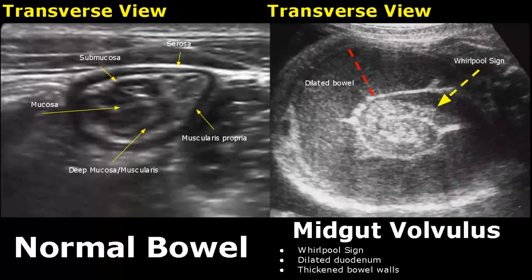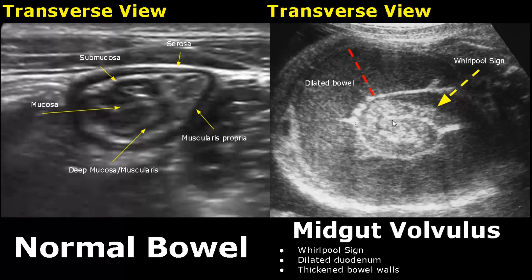Midgut volvulus occurs from malrotation of the bowel and can cause obstruction and ischemia. A whirlpool sign can be seen with dilated duodenum and thickened bowel walls.